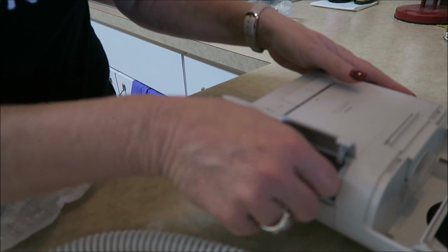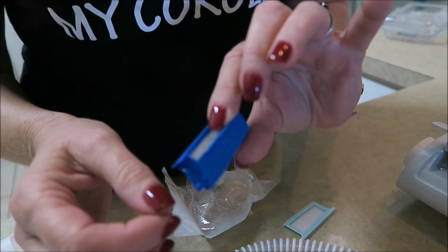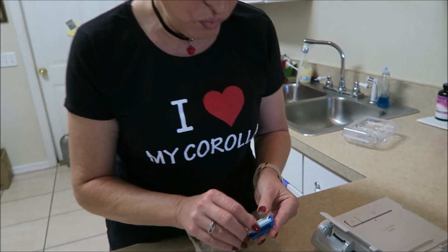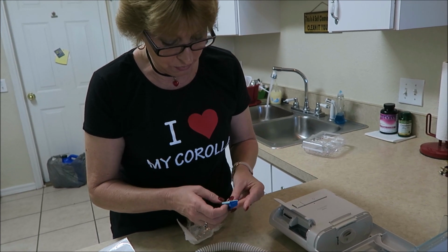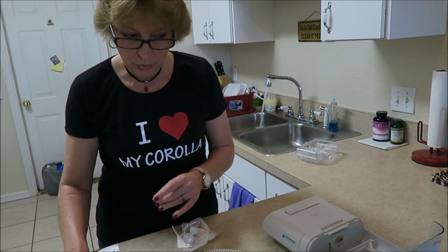Now this particular blue one, they have told me that I can take it and rinse it out with warm water, but it's really not dirty. They say to do that like twice a year, every 6 months. I haven't had it that long, so BB's good with that. Then you just put it back down.